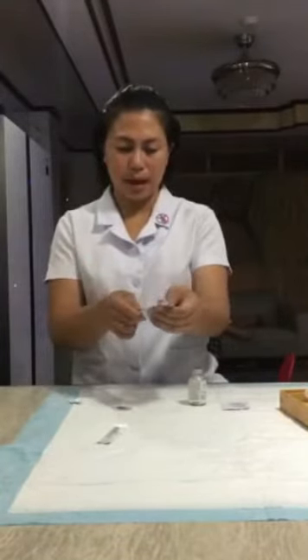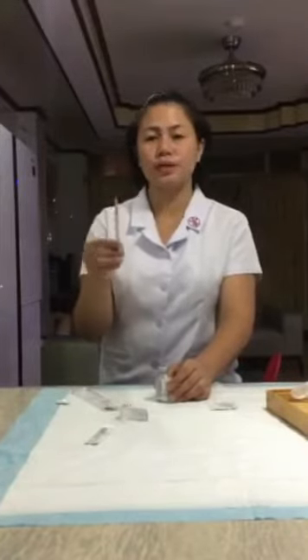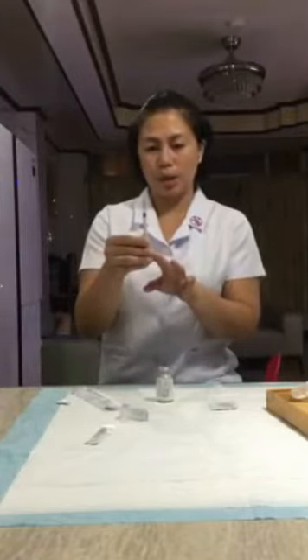Remove the cap from the needle, then draw up into the syringe the amount of air equal to the volume of the medication that we will withdraw. Carefully insert the needle into the upright vial through the center of the rubber cap, maintaining the sterility of the needle. Inject the air into the vial, keeping the bevel of the needle above the surface of the medication.